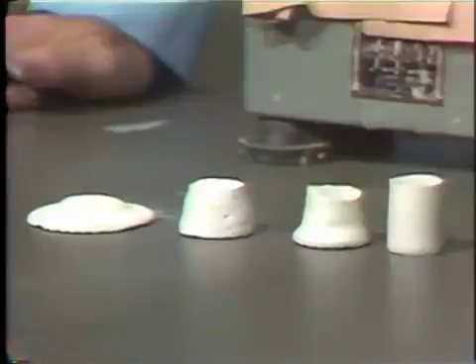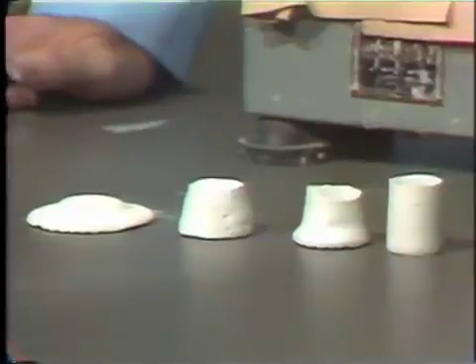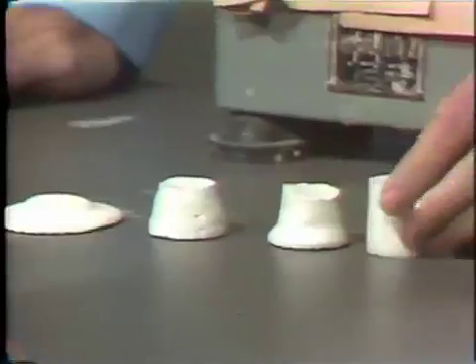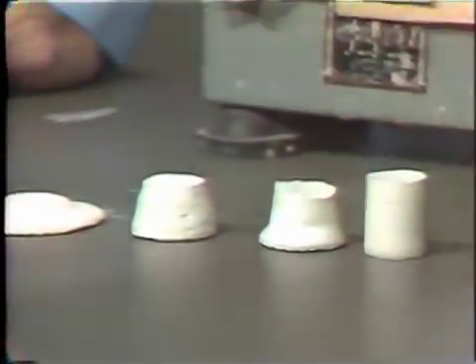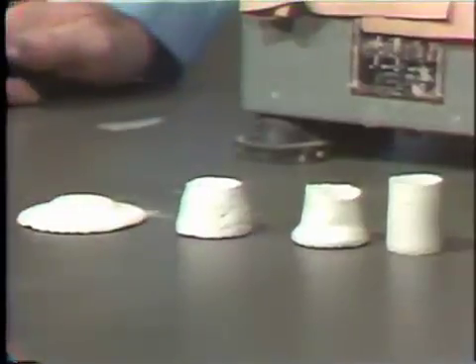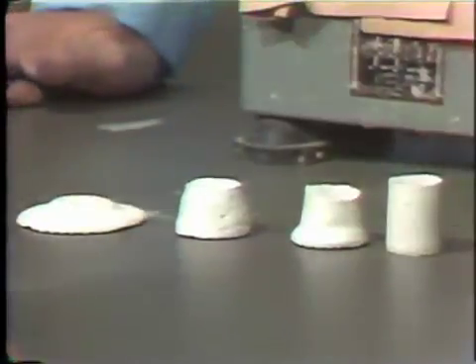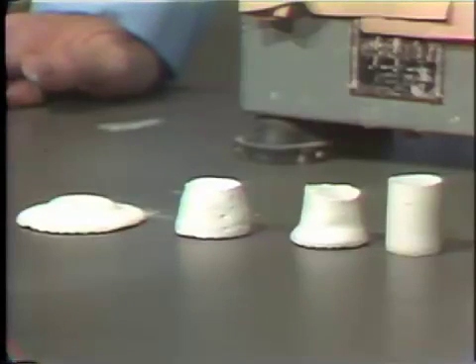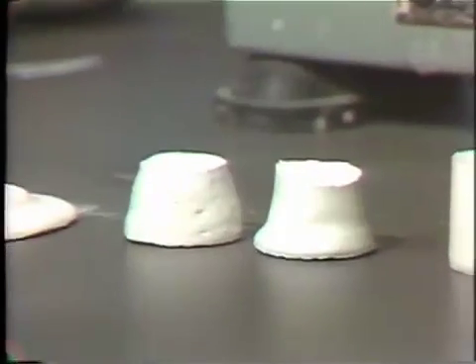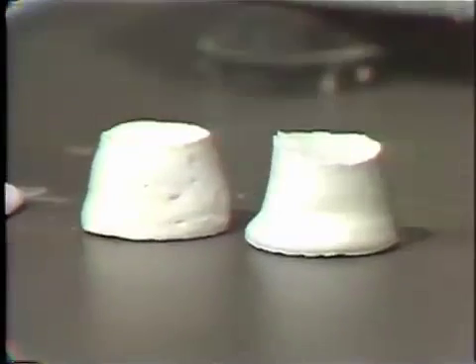What we need, of course, is an optimum consistency, something that we can pour. The thickest material would be too thick and would not flow readily into an impression. The thinnest material would be too thin and would be mechanically weak compared to the optimum consistency, which would be in the range of 50 to 55 milliliters, represented by these two middle materials.